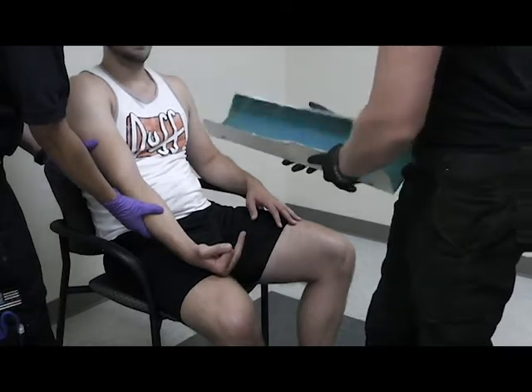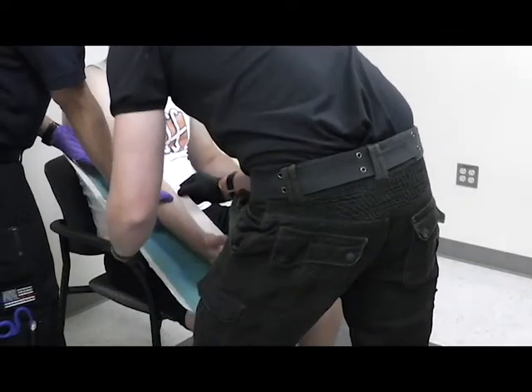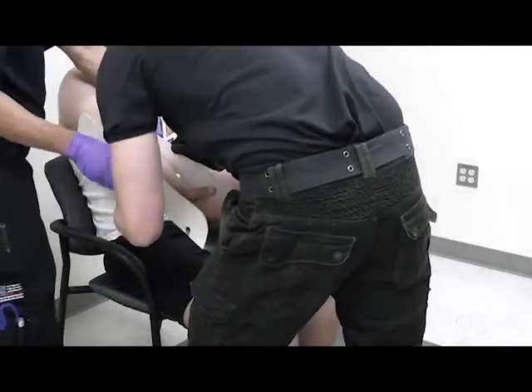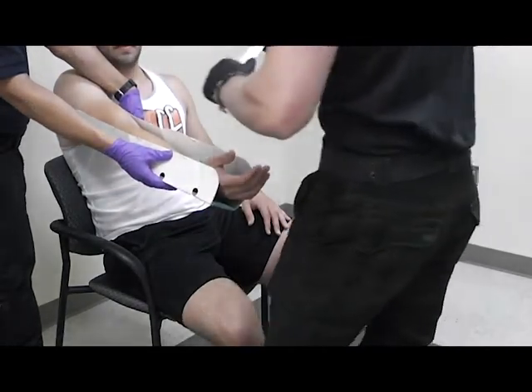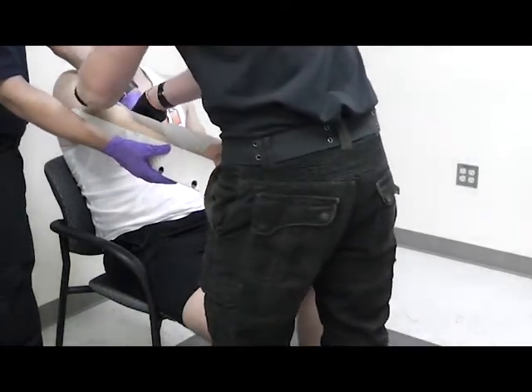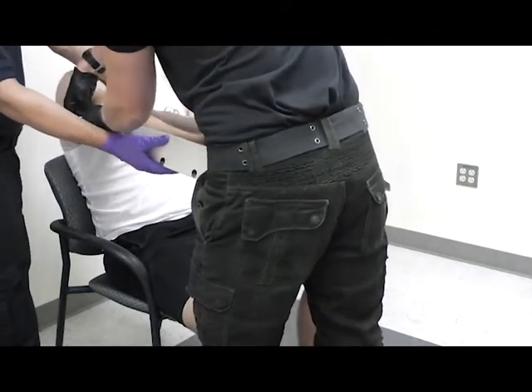Okay. Then you apply the splint and secure it above and below the injured joint.